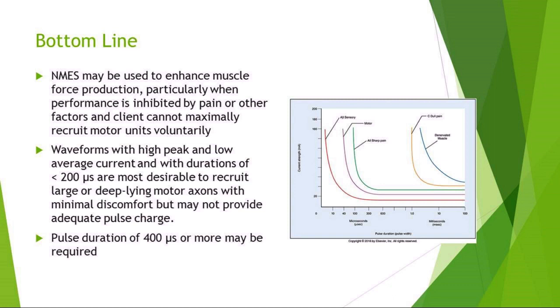Waveforms with high peak and low average current with durations of around or less than 200 microseconds are most desirable to recruit large or deep-lying motor axons with minimal discomfort, but may not provide adequate pulse charge. So the pulse duration of 400 microseconds or more may be required to recruit those large muscles.